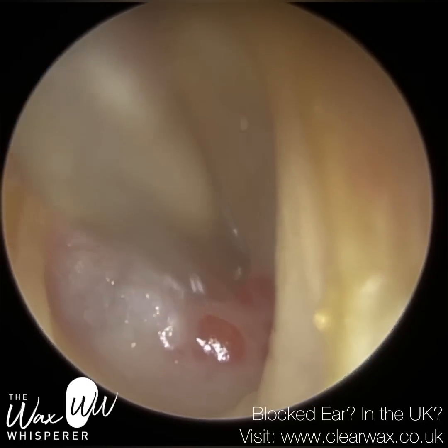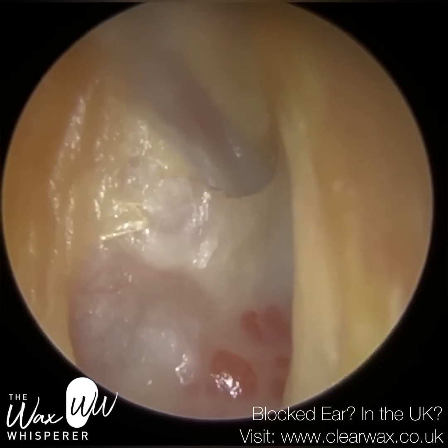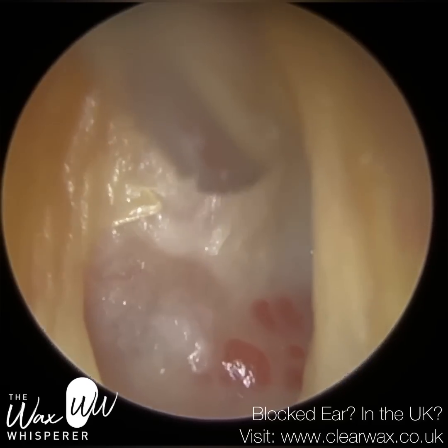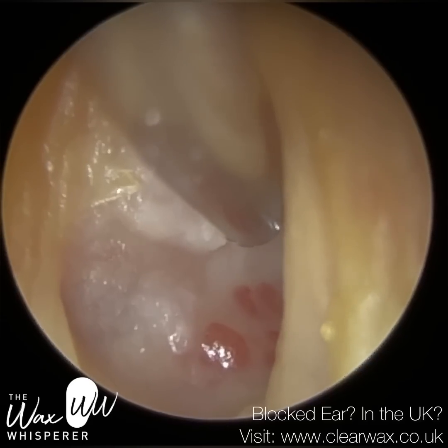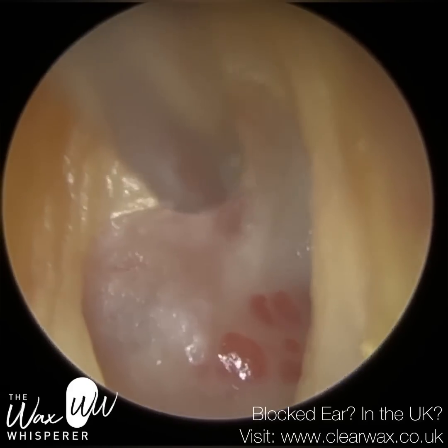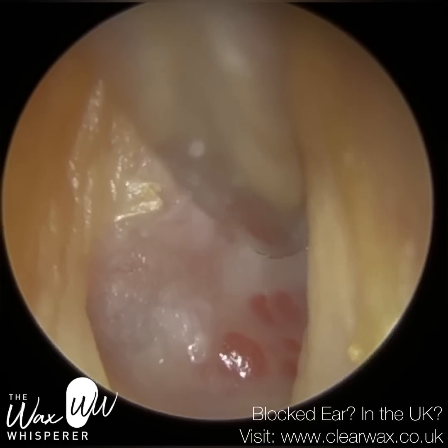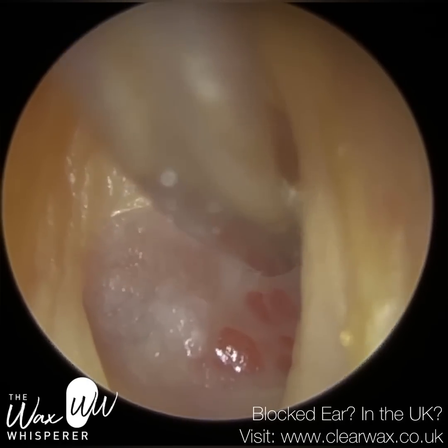So if you've got an infection of the outermost layer of the eardrum, the ear canal, or the flap of cartilage on either side of our ears, we call that otitis externa. Now, more specifically, this patient has got granular myringitis. Myringitis is when it's the eardrum itself, a more localized infection of the eardrum. And you can see the granular tissue at the bottom, those red bumps.